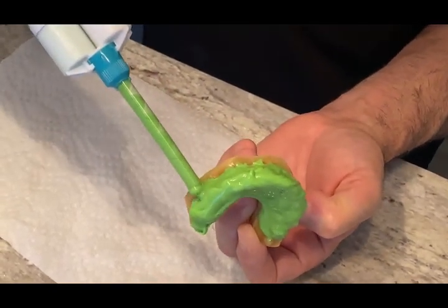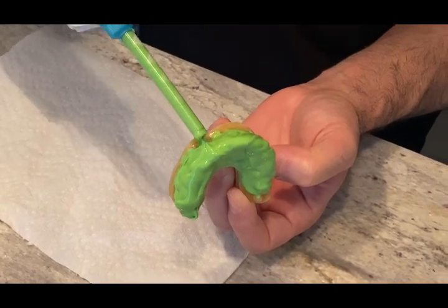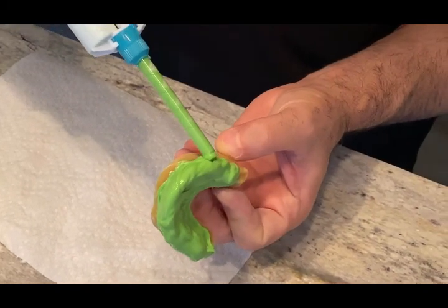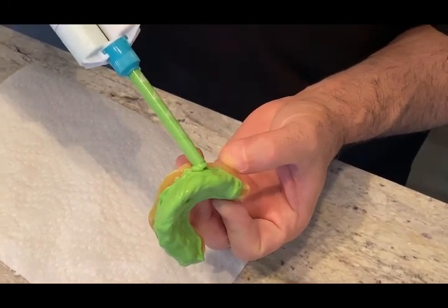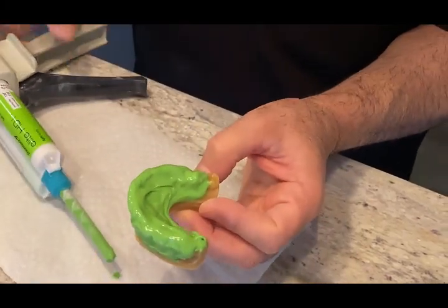There are no bubbles and it's all covered, and thick enough to capture the detail of the wax-up. This is the first step — let it set.